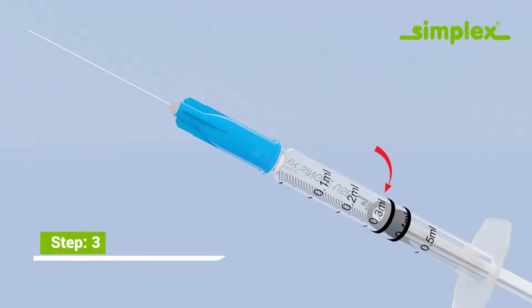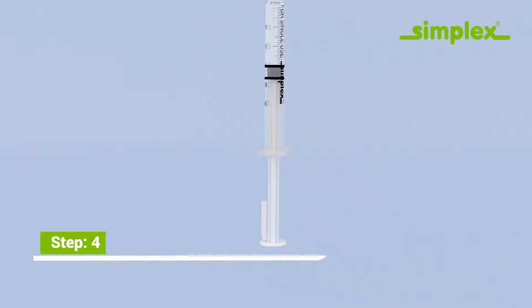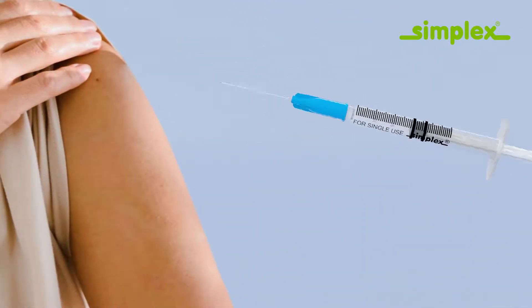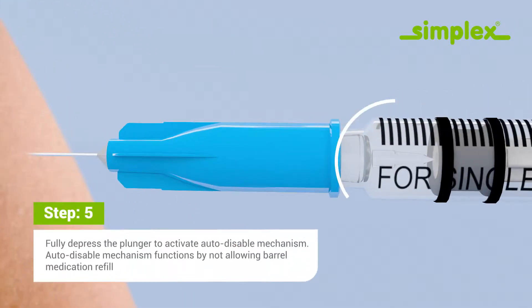Adjust according to the specific dosage. Take off the protector and give the injection using aseptic technique. Fully depress the plunger to activate the auto-disable mechanism.